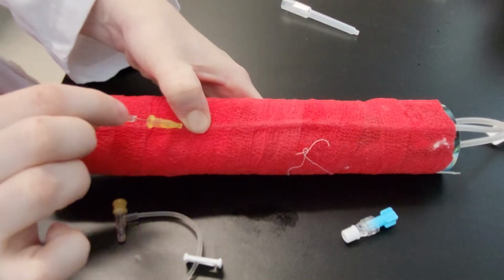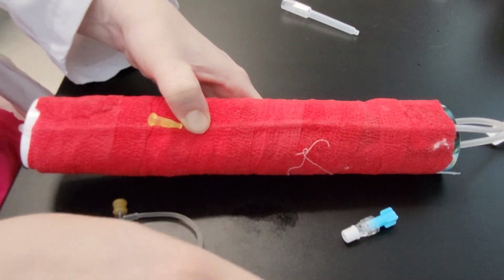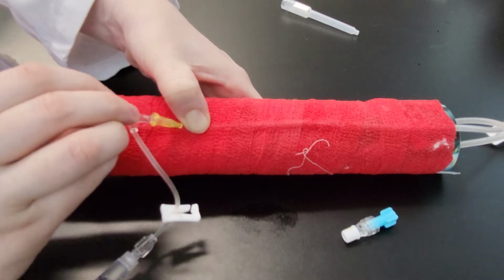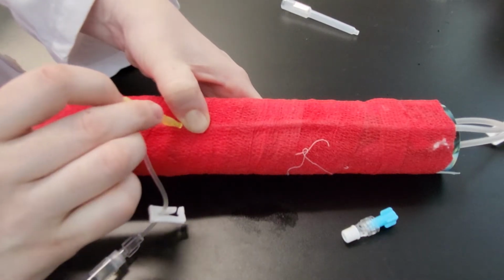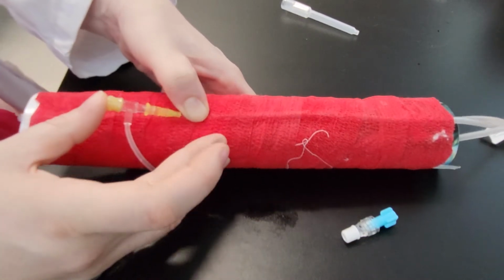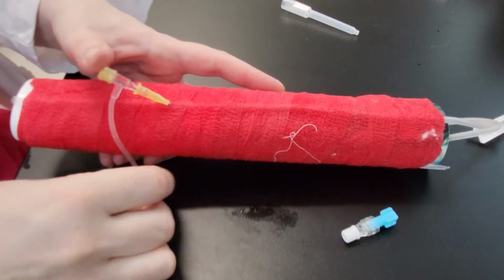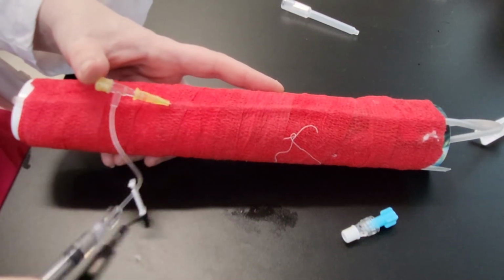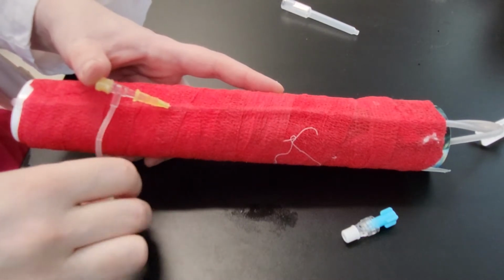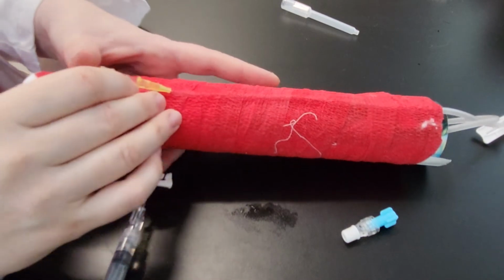I occlude to make sure that there is not a lot of blood coming back this direction when I actually have a patient and there's a lot of blood that might come back at you. So go ahead and place the T-port onto the catheter, and that's when you can let go. At this point, we are going to go ahead and flush, make sure that we are actually properly in the vein, which in this case we are. Once you know that you are in, go ahead and clamp off, and we're going to start with our tape.